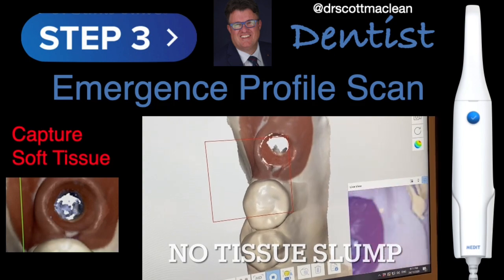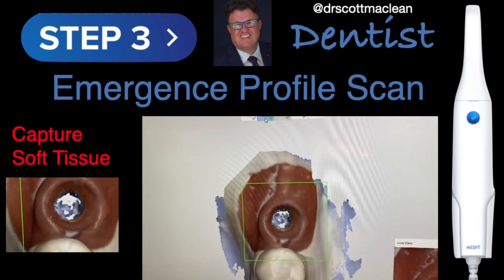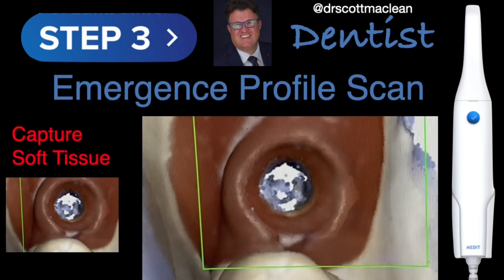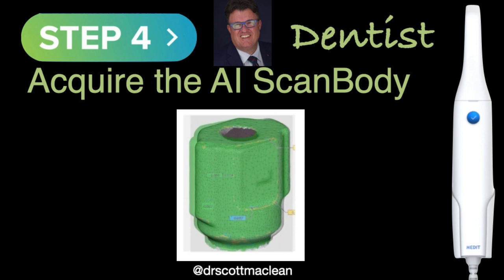because what happens is the lab technician is going to use this to fabricate the crown. And if you're doing, for instance, some type of custom temporary, which we do in the anterior all the time, you can remove this in the same fashion and pick up the scan of the soft tissues and allow the technician to really be doing a fantastic job for you. Now, step 4 is also done by the dentist, which is to acquire the scan body. Here it's an AI scan body, so artificially intelligent, so you get a fusion of the two scan bodies.